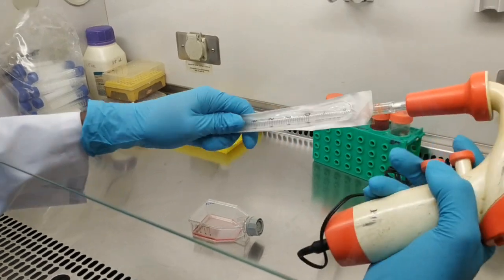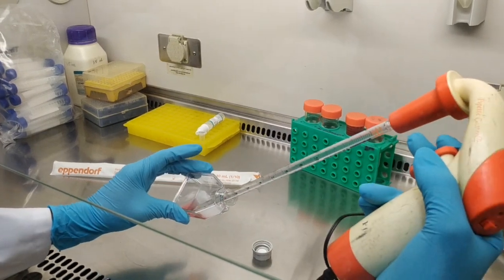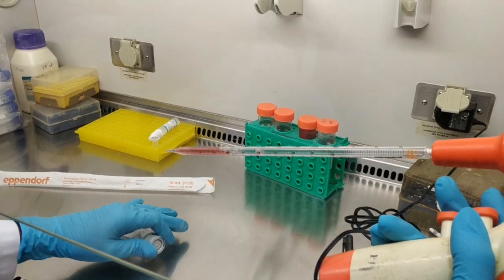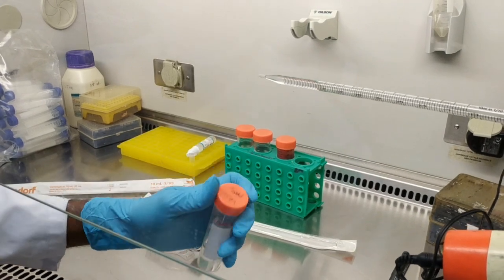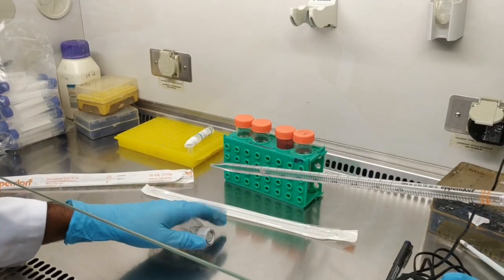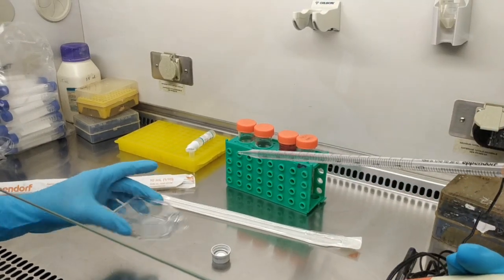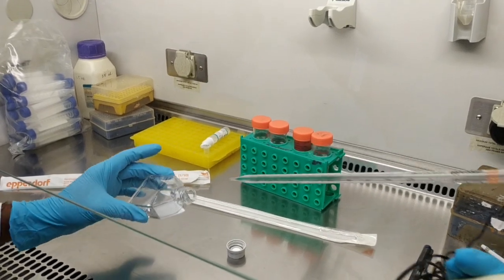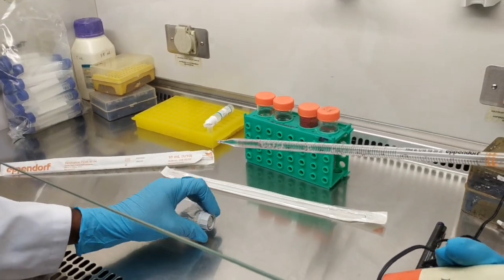Initially, you can remove the spent media or utilized media from the culture vessels by using serological pipettes, or sterilized tips can be used to remove the media. And then you need to wash the cells to eliminate unwanted cells, debris or dead cells by washing with PBS. The washing should be very gentle so that cells do not dissociate easily, and then you can discard the washed PBS.